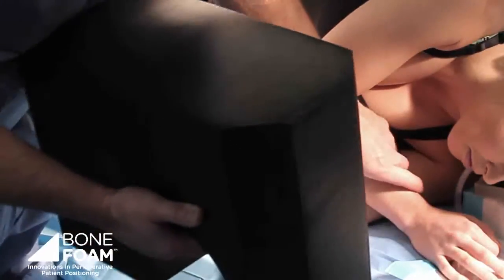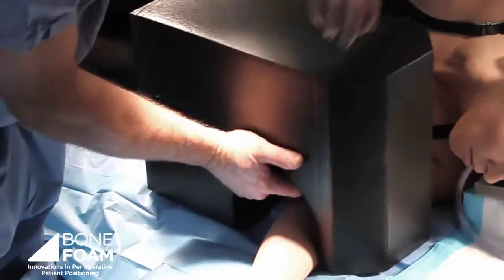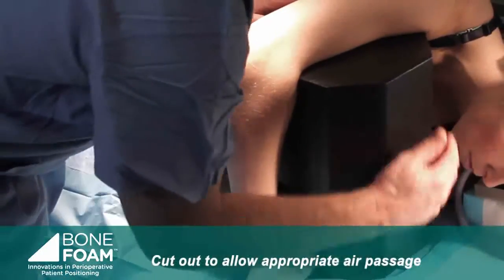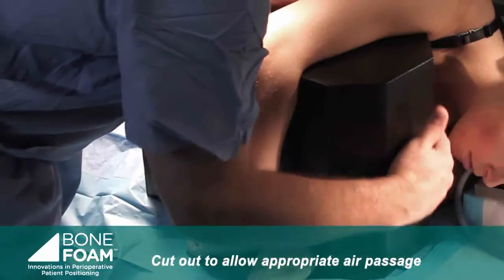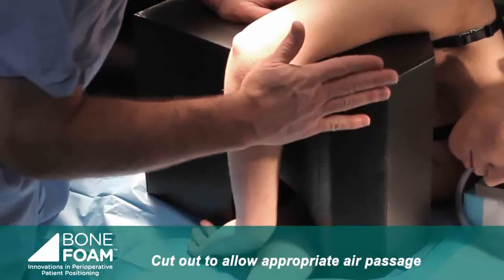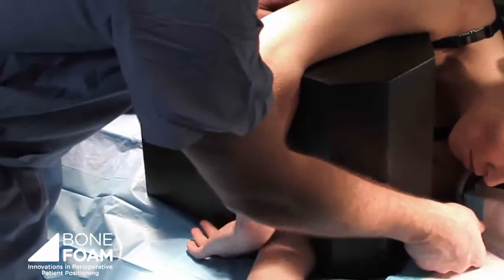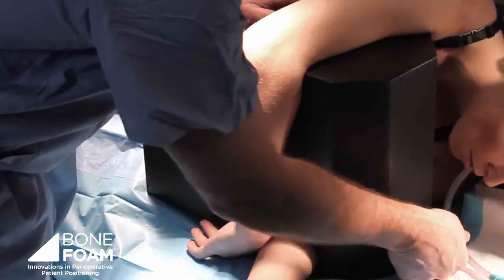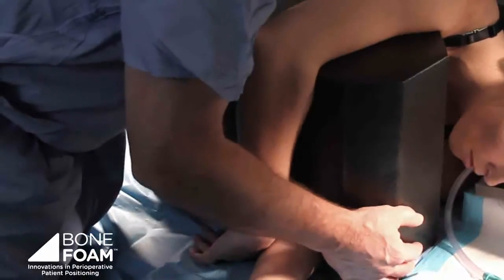I'm going to simply scoot this up against the patient, like so. And you can see that we have this new modification of the block by cutting these corners in such a way to make sure that the endotracheal tube does not compete with the corner of the block. That's a recent modification. Now this would be something that I use for distal humerus fractures, possibly olecranon fractures.